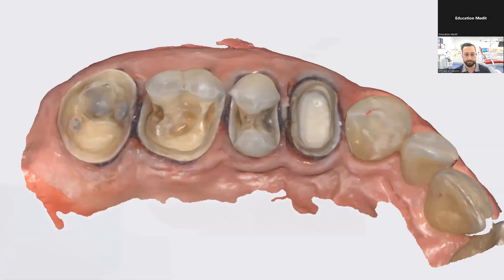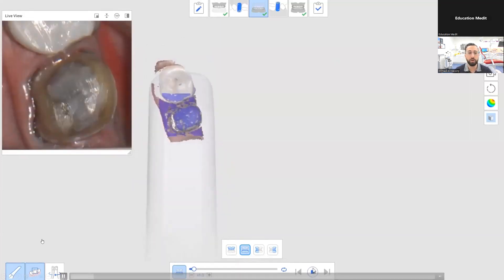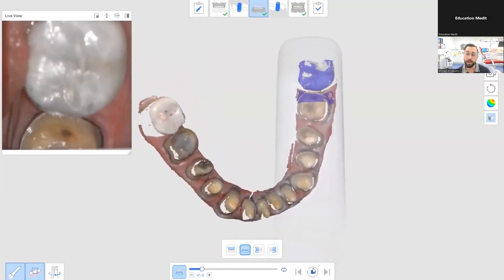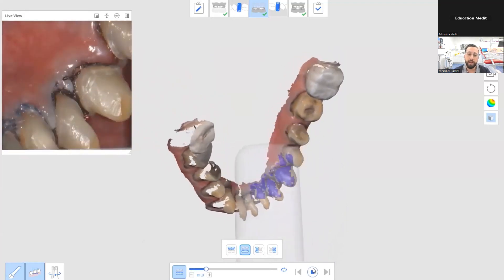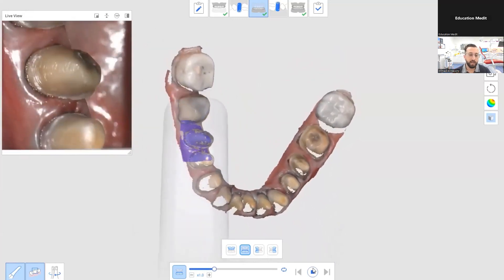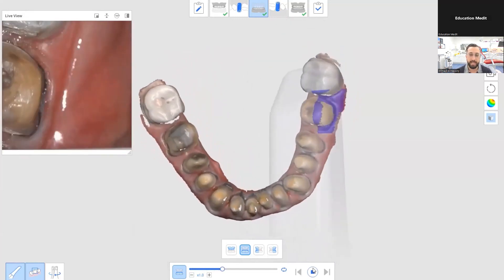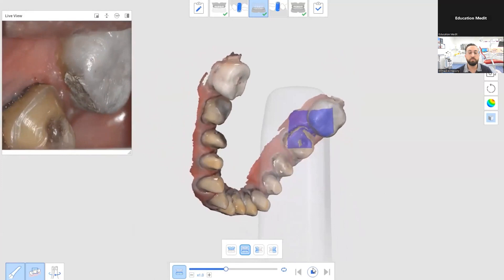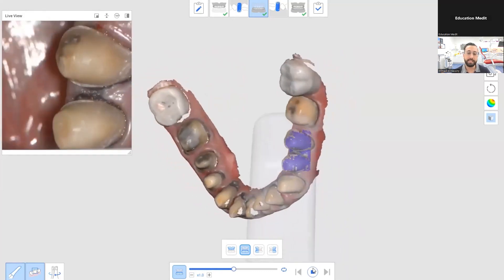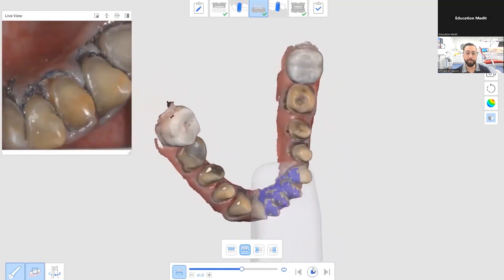The next thing is full mouth rehab. If you're doing a full mouth rehab, how do you take a scan? This is a real-time scan video of a full mouth rehab, and as you'll notice, I'm doing the same scan strategy: start on the occlusal, go all the way around, scan the buccal, rotate again, then scan the lingual. I am not distracted by the fact that there are a whole bunch of preparations there — that is how you should approach your scanning. You always follow a strategy.